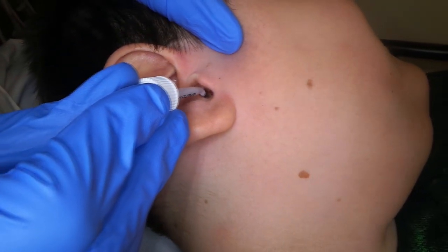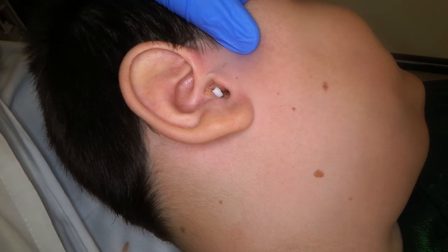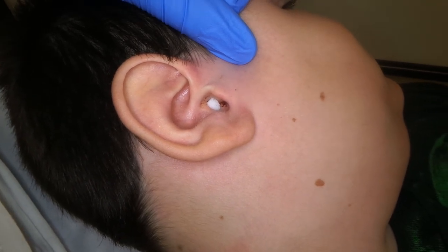Perfect. Let's see what happens when you put the drops in there. I had an ear wick the other day that I put in a person's ear and the drops would not — for some reason — it would not expand at all. It's kind of frustrating.